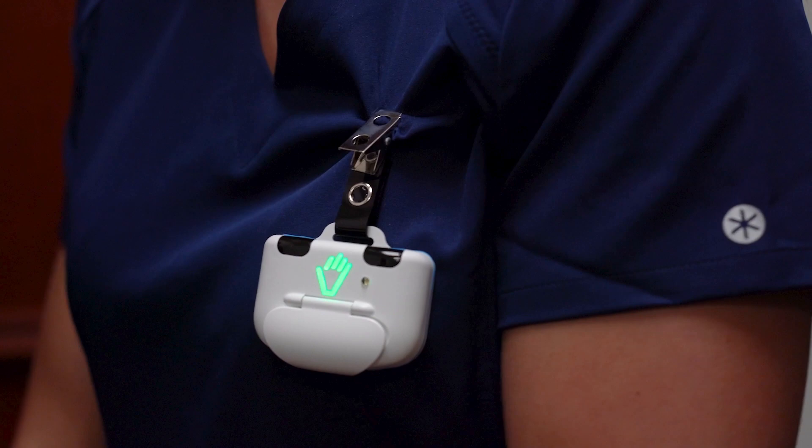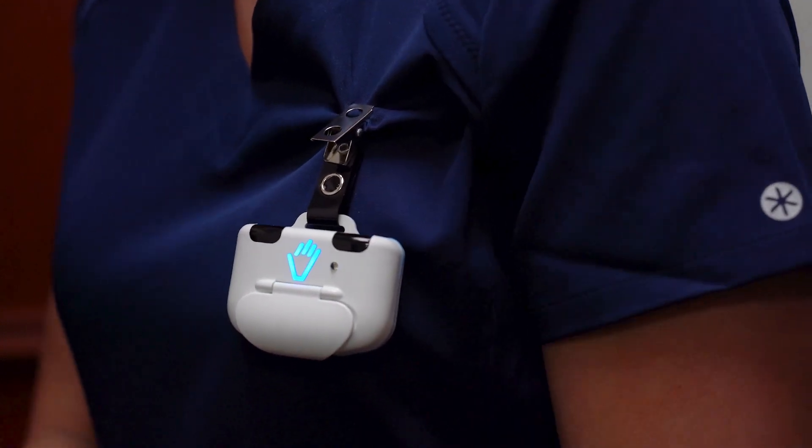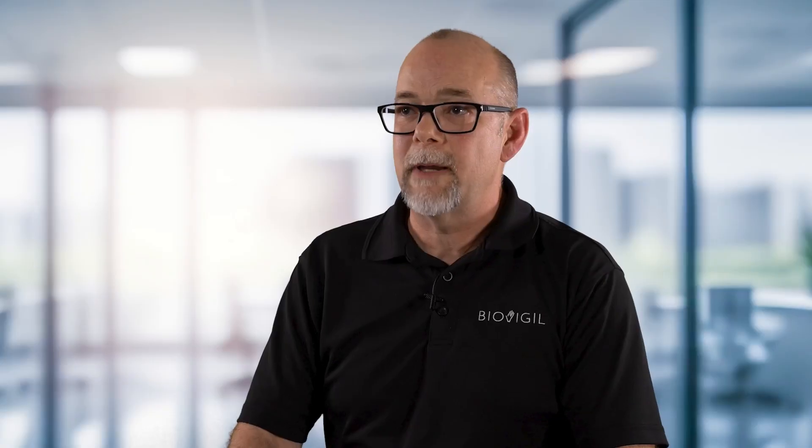Once the sink beacon turns green, the beacon will tell the badge to turn blue. Once the badge turns blue, the user can accept credit for the sink event by pledging the badge, and the badge will turn green.